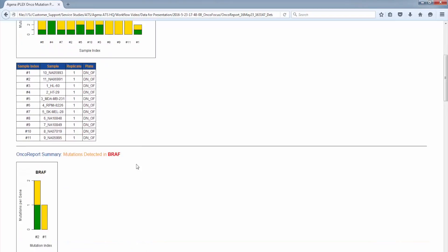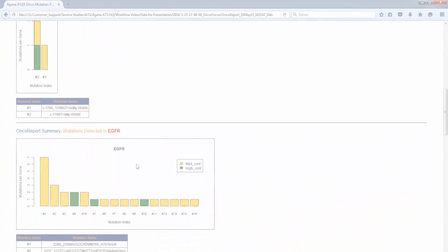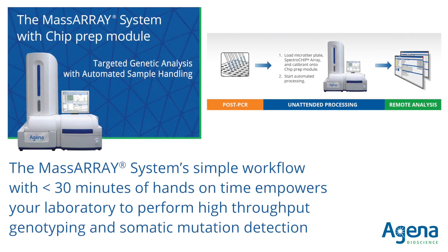With less than 30 minutes of hands-on time, the MassARRAY system with chip prep module delivers reliable results for nucleic acid testing. Whether identifying somatic mutations for clinical research or doing high-throughput sample identification, the MassARRAY system's workflow can be quickly and easily integrated into your lab's processes.